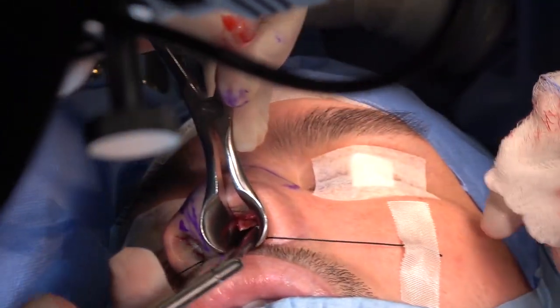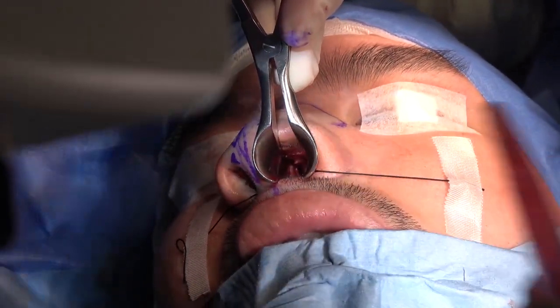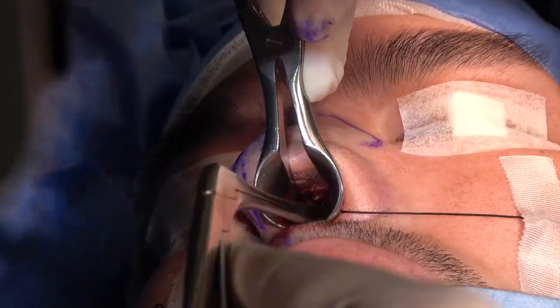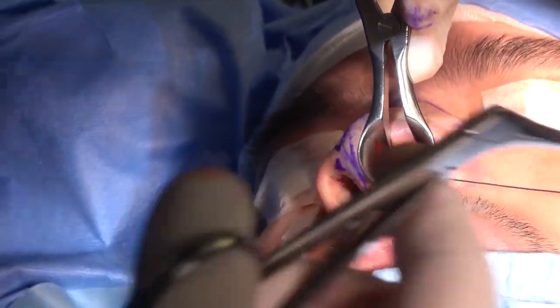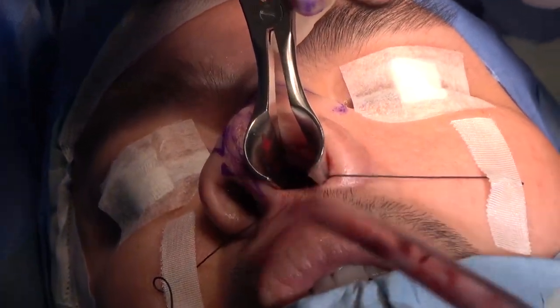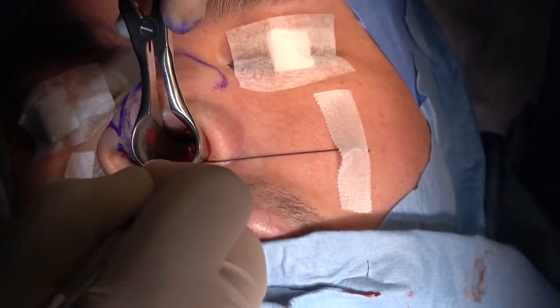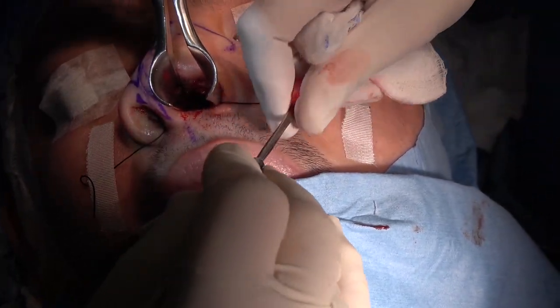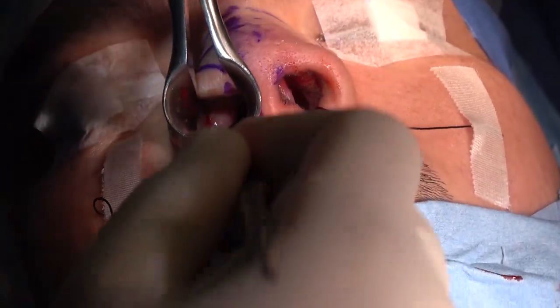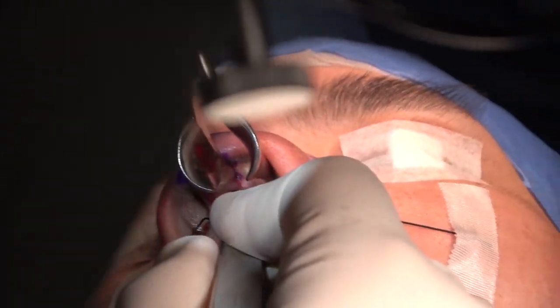You see all bone now. Suction. Lot of bone, kinked bone. Doing the septoplasty. Okay, give me the scissors. Go to the floor, over the maxillary crest. And then this piece of cartilage over the maxillary crest. So now, as we have done, see intact flaps on both sides. We have enough septoplasty. Now we start the rhinoplasty, the intercartilaginous incision, junction between the skin and the mucosa.